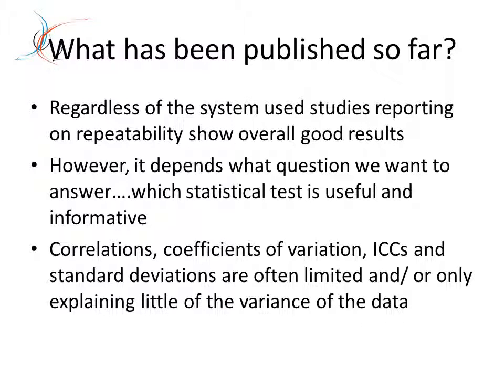There are a couple of publications out there which haven't looked at comparing protocols, but at test-retest, whether short term or within one session, and the majority overall have shown pretty good reproducibility or repeatability results. However, I think the question isn't just about doing those studies, but about how we analyze the parameters that we get out of it.